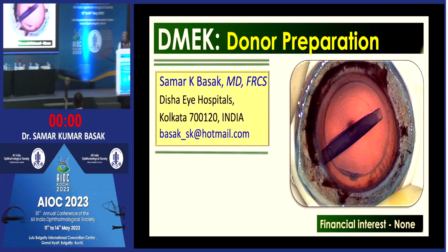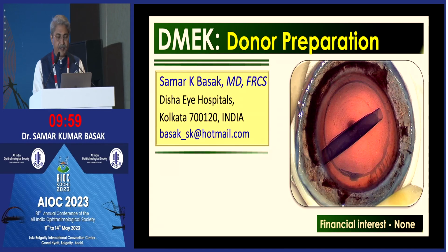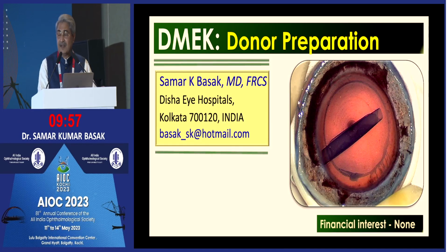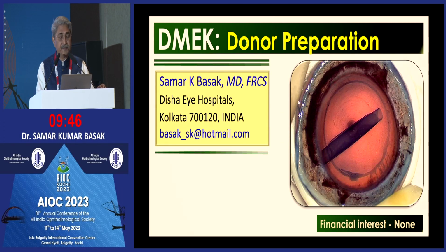I do not have any financial interest. So I will be dealing with two parts. One is donor preparation and another is the donor insertion and unfolding. But the major part of unfolding and other types will be tackled by Rajesh also.